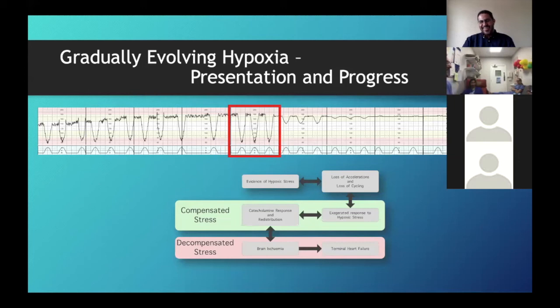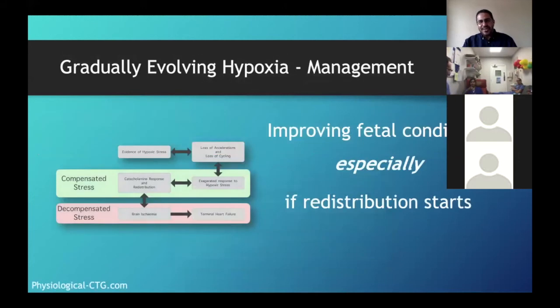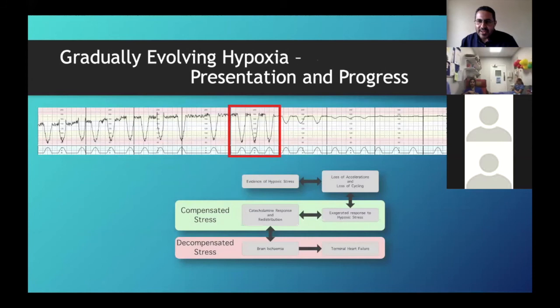Quality improvement project, yeah. What she was saying though, that we've not had any reduction in cesareans or instrumentals because we're not trusting STAN enough. So that's what she's saying. What Susanna's trying to say is that people are panicking too early on. They're panicking once there's a rise in baseline. Okay, you still have a lot of space and leeway there.